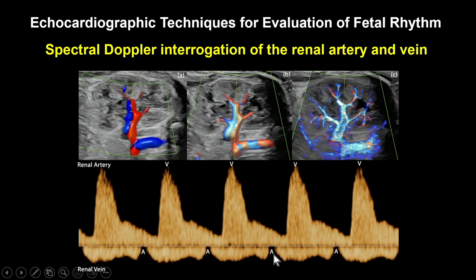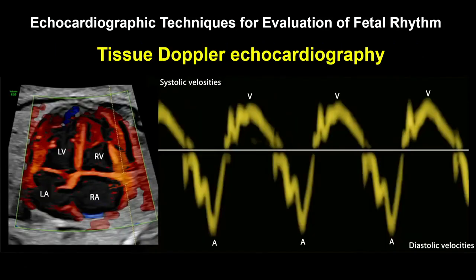We are looking at the atrial contractions on the venous flow, and we look at the ventricular contractions in the arterial flow. And finally, the tissue Doppler technology that we were able to demonstrate yesterday. So here we have the trace, and again, we usually apply the spectral Doppler gate on the lateral aspect of the tricuspid annulus, like for the measurement of the other parameter, like TAPSE.